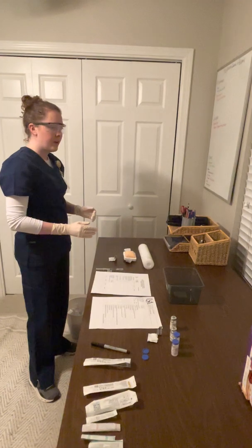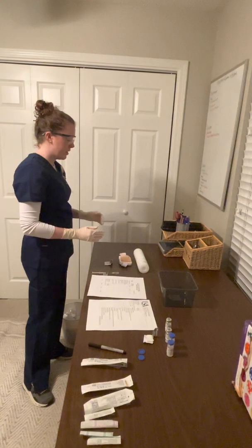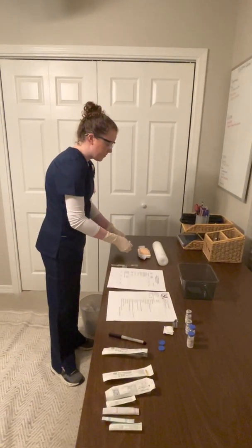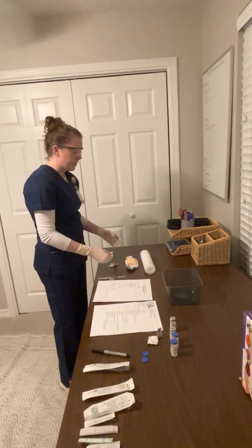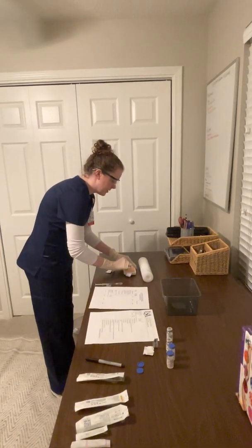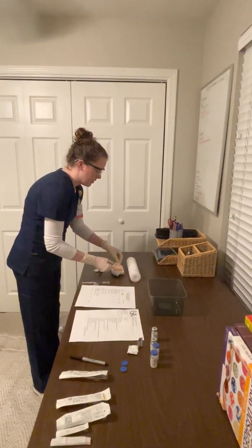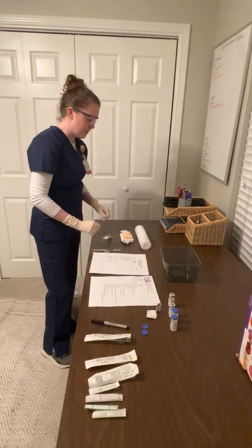Next, I would remove any covering that the patient would have on the abdomen, such as a gown or a bed sheet. Then I would go ahead and clean the area of the abdomen. I would also at this time inspect the skin for any integrity of the muscle or any bruising that the patient may have. And I would clean the skin in a circular motion, working my way outward with an alcohol prep pad. And then I would point to the location where the site was cleanest.